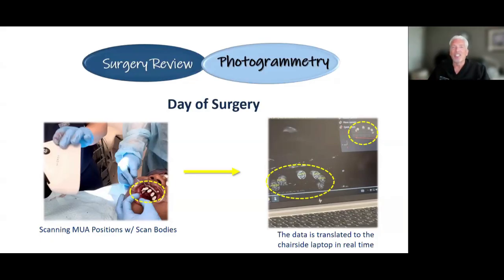Right from there, you just click. You've communicated with the lab ahead of time. They know these scans are coming. So if they're going to do a design for you, it's all set up. As soon as that hits their computer, the designer at the laboratory is putting together the scans you took a couple of weeks prior, merging that together, either to give you a design you can print in your office that same day, or next day delivery, which we're seeing is a very popular way to go. Patients just want to go home, go to bed.